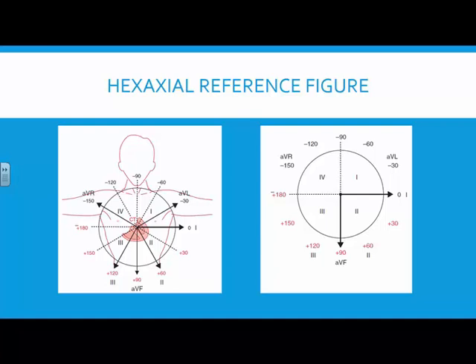All right. So let's just start. Here's your hint. The first three lines that I'm going to draw are going to be leads 1, 2, and 3. So the line that goes this way, this side is negative and this side is positive, is what? Lead 1.